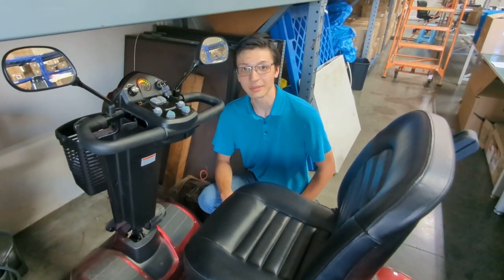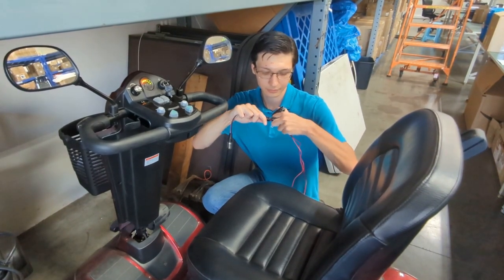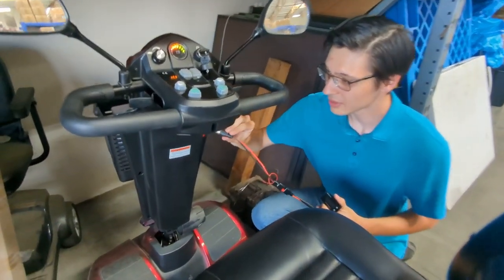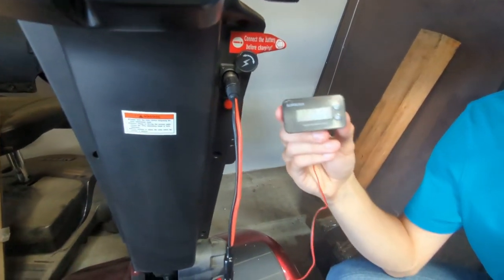Now using our battery meter is quite easy. There's only a couple steps. The first step, you'll need to connect the battery meter to an XLR adapter. For the second step, you'll connect the XLR adapter to the charging port of the mobility scooter. In a moment, you'll get an accurate reading of the voltage and power output.